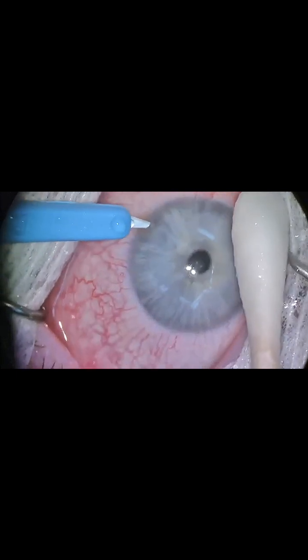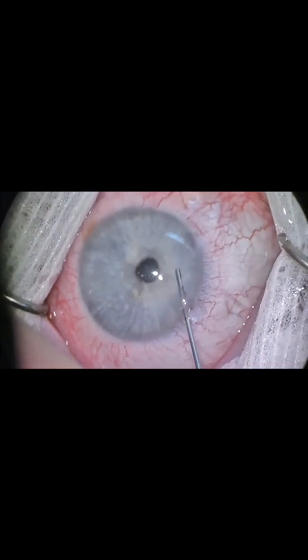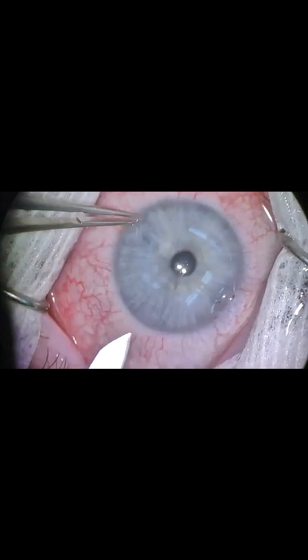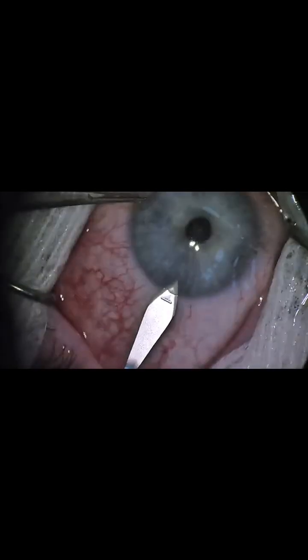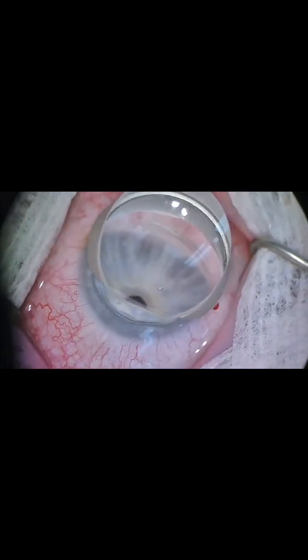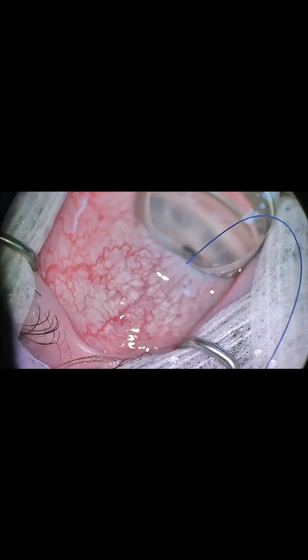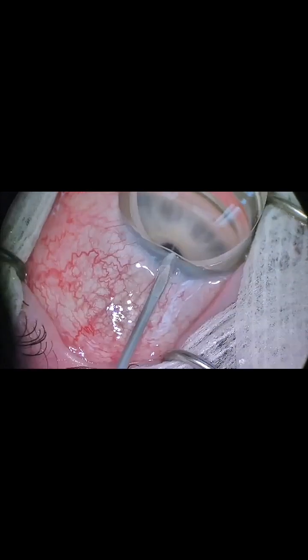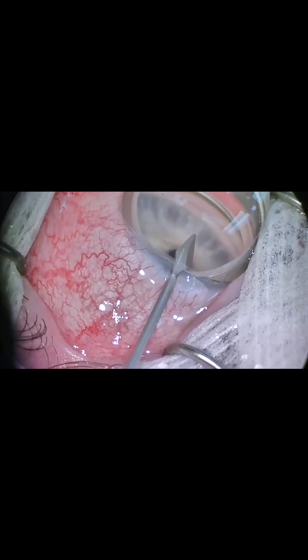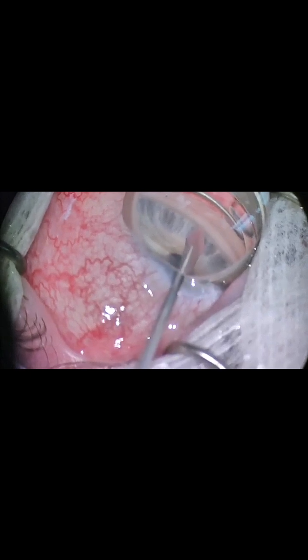A 22-year-old man, a case of uveitic glaucoma with a pressure of 40 despite topical medication and also oral Diamox, and the plan is performing a GATT procedure. After creating the required corneal incision with the aid of a gonio lens, an incision is created over the trabecular meshwork to get access to Schlemm's canal. In this part, an MVR blade is used.